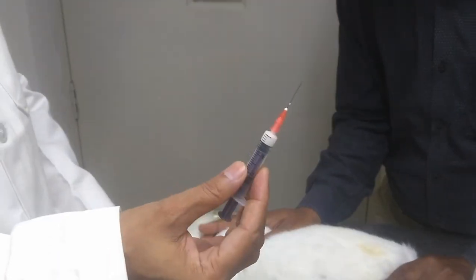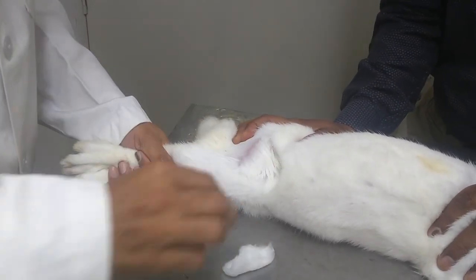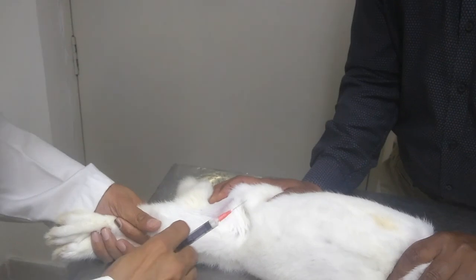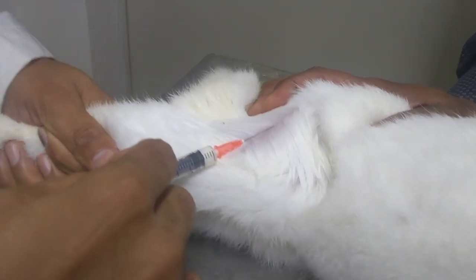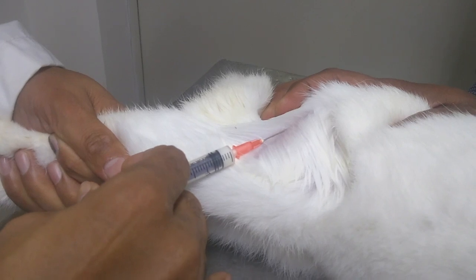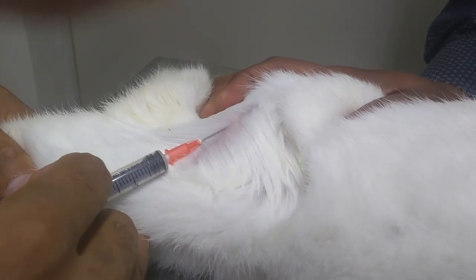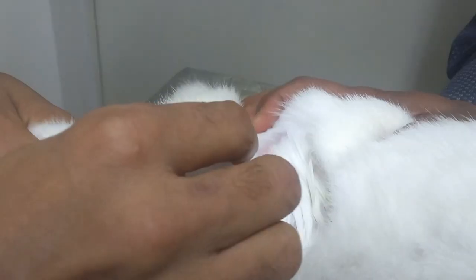This is our emulsion that we have prepared by the microemulsifying needle, as we have seen earlier. This is the area where we would like to inject. We have to take out all the air from the syringe and the needle. We have taken it out, and we clean the area again.